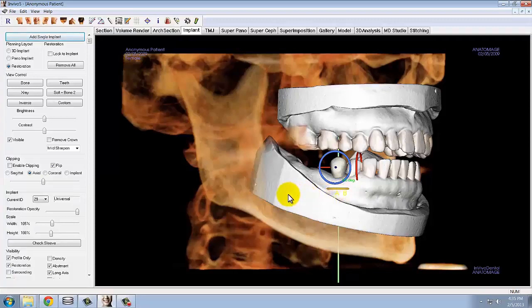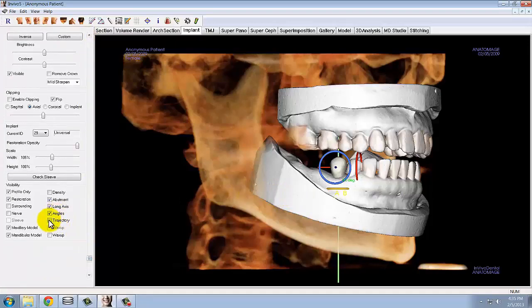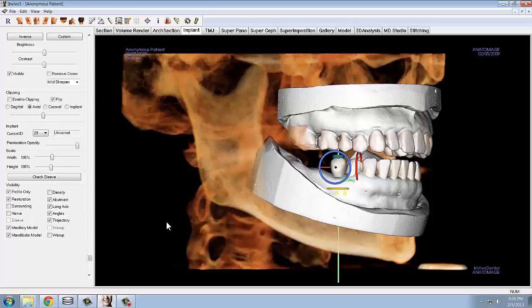Use the visibility section in your control panel to enable the trajectory and long axis of the implants to show in your rendering window. The trajectory visibility function will allow you to see the implant trajectory through the restoration. The long axis visibility function will allow you to see the central axis of the implant, which can be used to compare the angulation of implants. The value in degrees that appears next to the implant indicates the angulation between that implant and the adjacent implant.